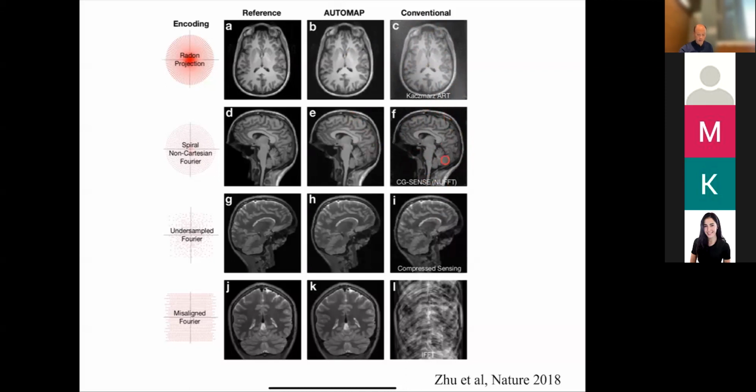But here, this algorithm probably took at least 10 smart people 20 years to develop. Okay, just the theory behind this and all the algorithms, right? And it's replaced with 5 lines of code, and AUTOMAP can just do it with the training. And these algorithms also take a long time to execute. The cool thing about deep learning is once you've done the training, you just have these coefficients, and it's very fast to do. It's a forward calculation. These algorithms involve a lot of iterative, highly computational computations.